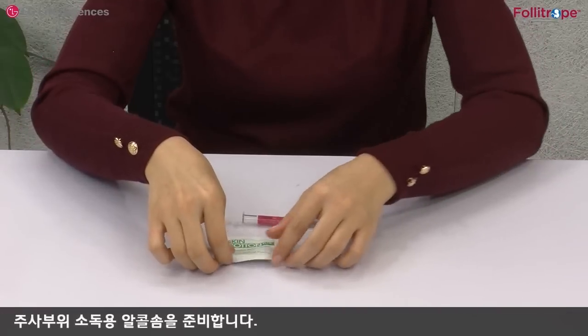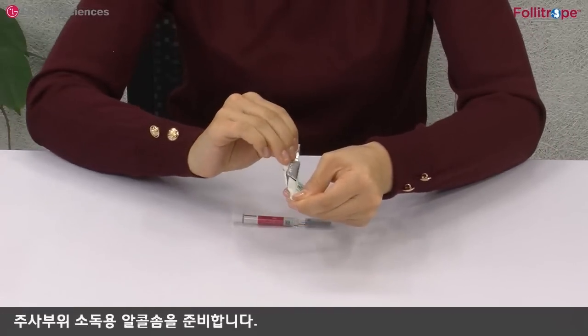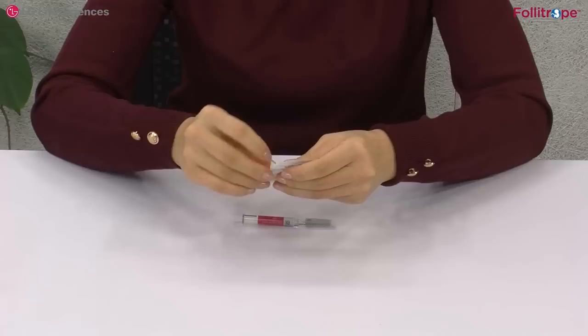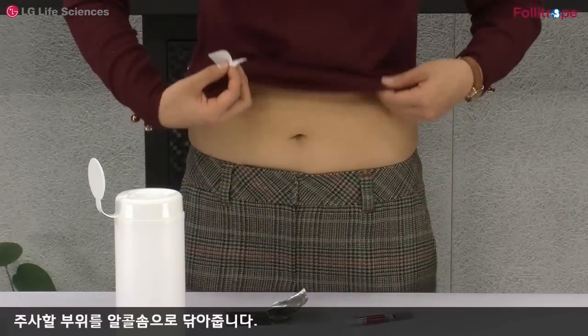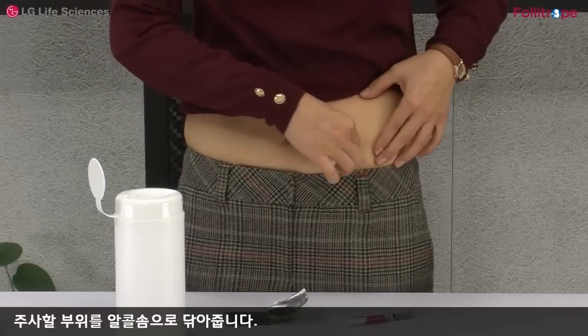주사 부위 소독용 알코올 솜을 준비합니다. 주사할 부위를 알코올 솜으로 닦아줍니다.